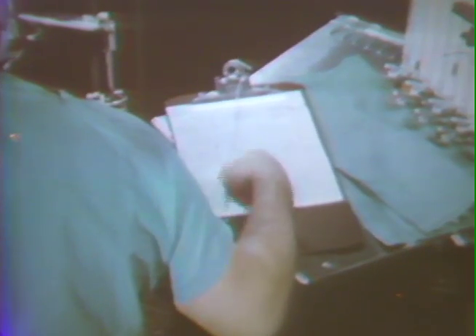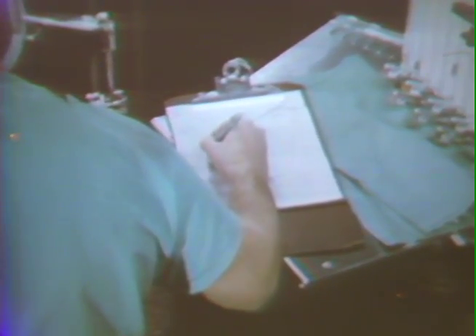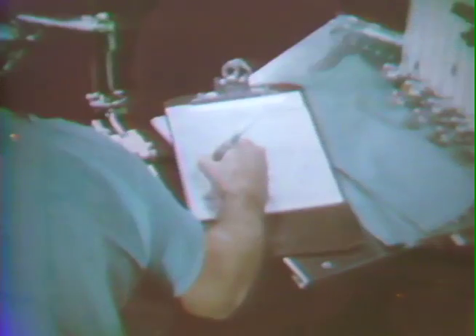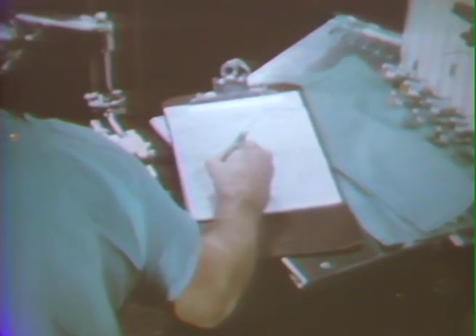To ensure his patient's safety, the anesthesiologist constantly observes the patient's reaction to the anesthetic. He repeatedly monitors pulse, blood pressure, and respiration, altering anesthetic concentration as indicated. He carefully records his observations in sequence on the clinical anesthetic record. The halothane concentration is gradually increased as tolerated by the patient. The drug is non-irritating and easily tolerated. Consequently, induction is not hampered by coughing and reflex laryngeal spasm.